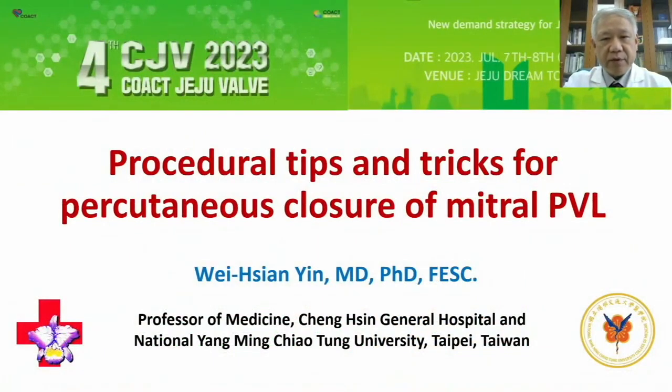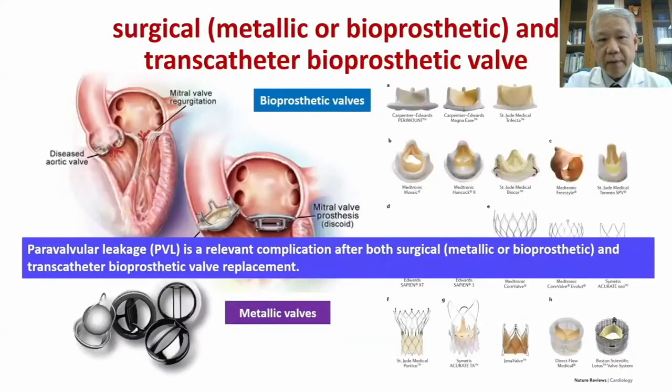It is my great pleasure and honor to discuss with you procedure tips and tricks for percutaneous closure of mitral leaks. As we know, leaks are a relevant complication after both surgical metallic or bioprosthetic and transcatheter bioprosthetic valve replacement.